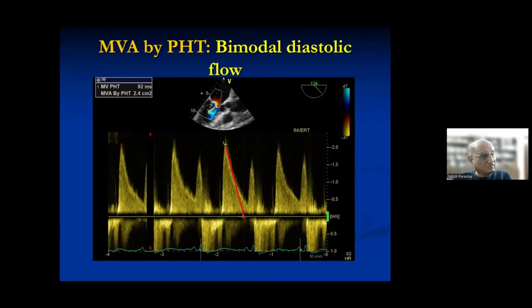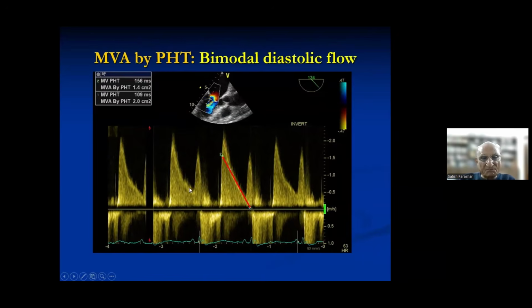So you see, now here what we have done, we have measured from here to here, and you find an area coming as about 2.4 centimeters square. So you see, the mistake is that, just to demonstrate, measure here. This is the rapid slope. We avoid it. That is just to show. And if you measure from this to this, it becomes 1.4. So never measure here. Measure from here and go backwards.